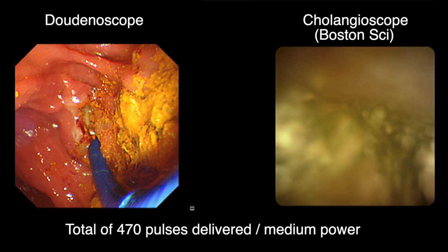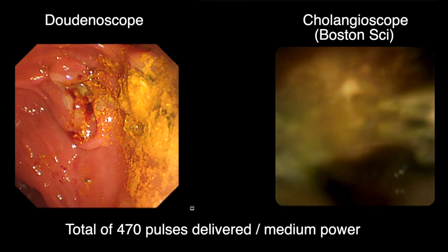Eventually, the stone is broken up into manageable fragments and the cholangioscope is removed.